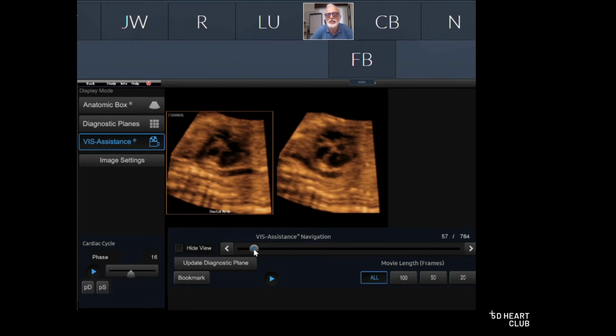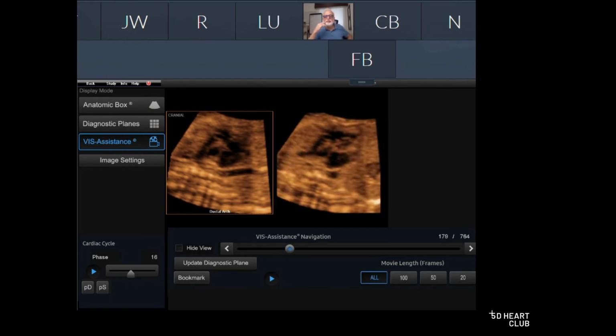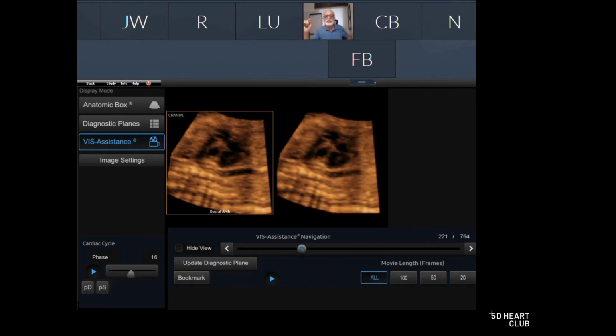That's a neck vessel connected there. Keep going. Okay, stop. Neck vessel. This is the neck vessel. Yeah. Okay, keep going. Keep going. I want to see now the entire aorta very black, filled with blood. Keep going to the right. Okay, it's coming. Okay, stop. Too much. Return. Just a little bit. I think so.